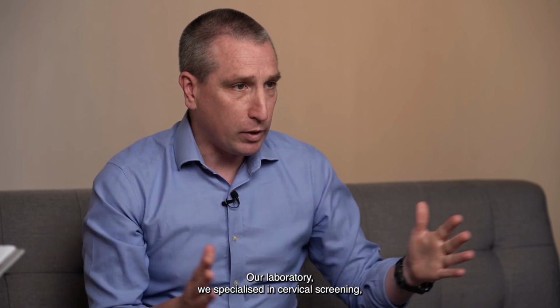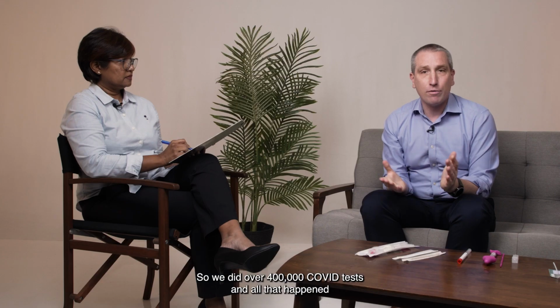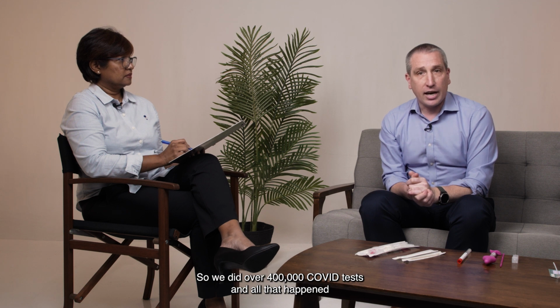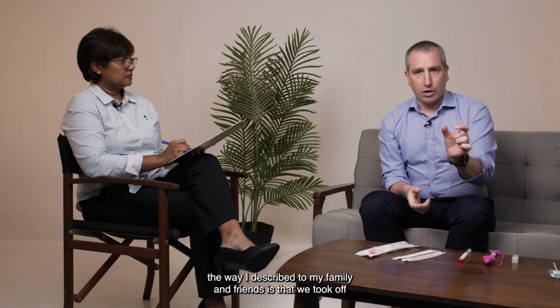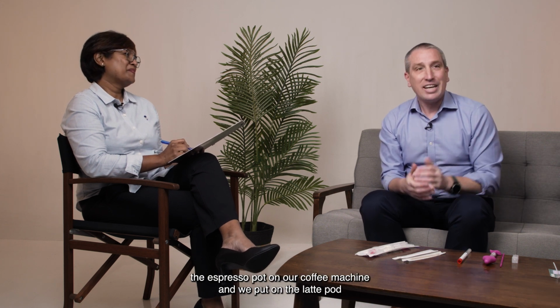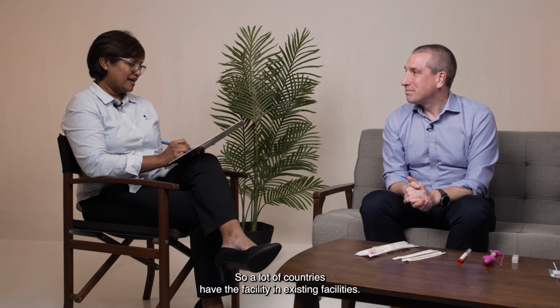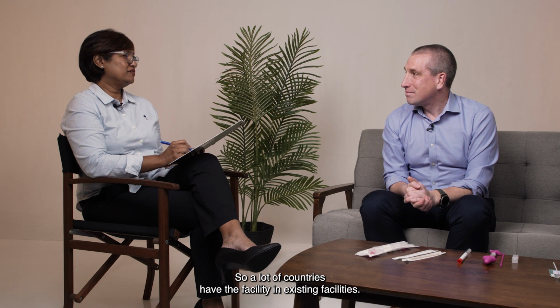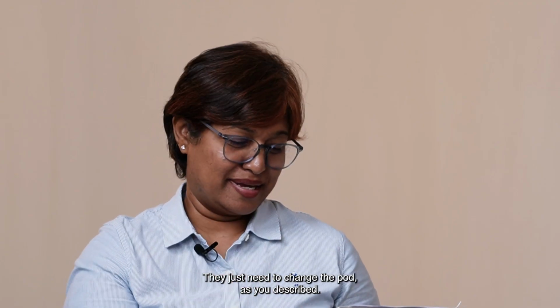Our laboratory, we specialise in cervical screening, but obviously it's a global pandemic, so we did over 400,000 COVID tests. And the way I described it to my family and friends is that we took off the espresso pod on our coffee machine and we put on the latte pod. And that's really as simple as it is. It's exactly the same machine. So a lot of our countries have the facility, existing facilities. You just need to change the pod, as you described.